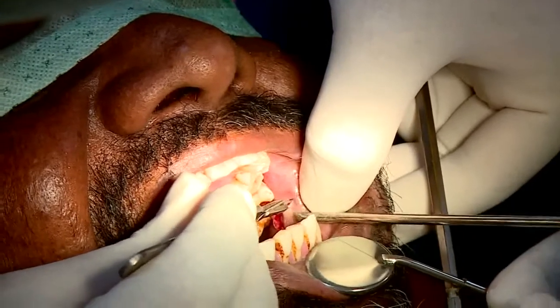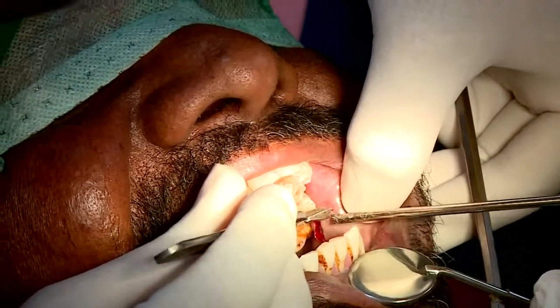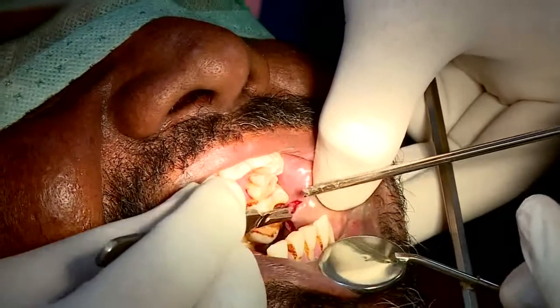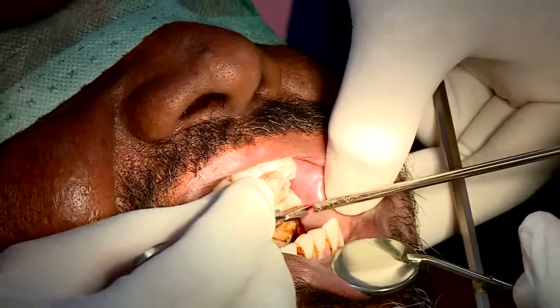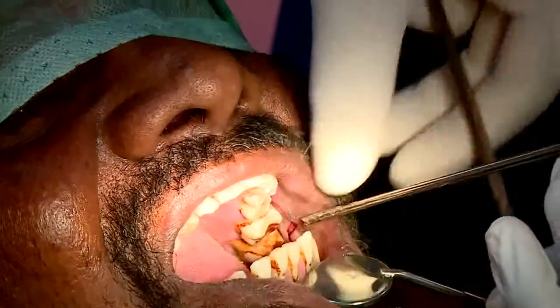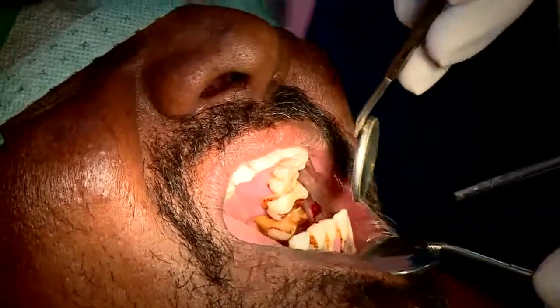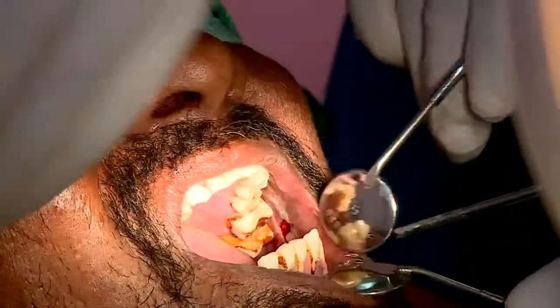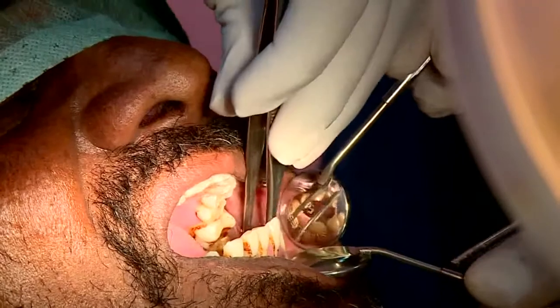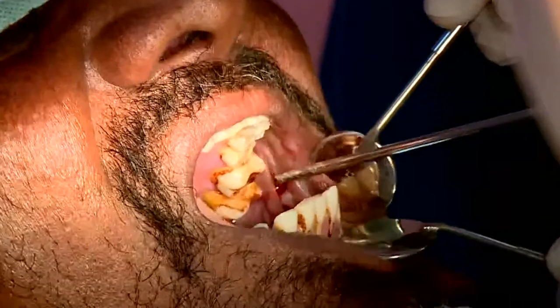Again, why do you think the depth is of much importance here? What happens if you don't give an adequate depth in a case like OSMF? Yeah, very good. You will appreciate the connective tissue changes here. The problem is the hyalinization of the connective tissue which is causing the fibrosis there, and you also need to see the epithelial changes here. So without an adequate depth, you will not be able to come to a proper conclusion at all. And so is the case of a carcinoma. If you are not including your connective tissue in that, just looking at the epithelium alone will not suffice.